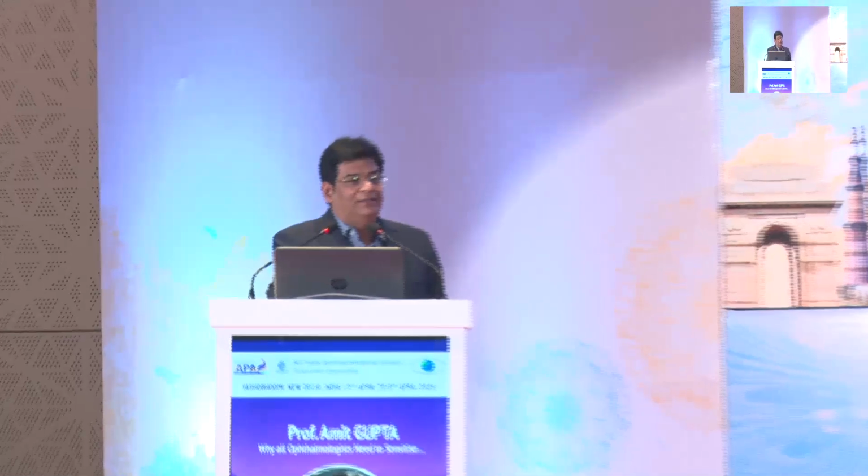The aim of us when it comes to using a toric IOL is, one, to see whether the surface is regular or it has an irregular astigmatism, which is fairly clear when it comes to just if you see a 4-map refractive, it is all right. We can go to the TCRP maps or to TrueNet Power maps. I don't use that usually. I rely on the IOL Master. I do take a look at the Pentacam, but I don't use those readings of Pentacam to plan my toric IOL surgery. I don't do that.